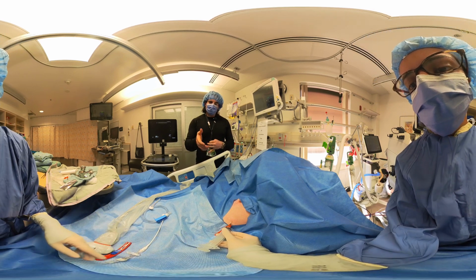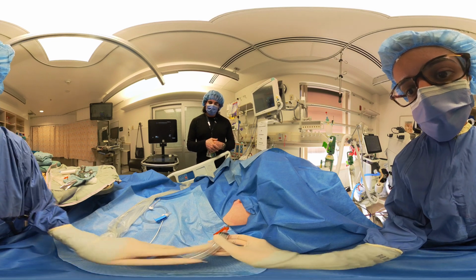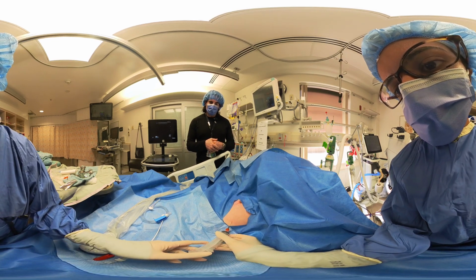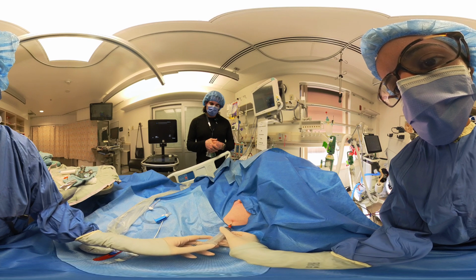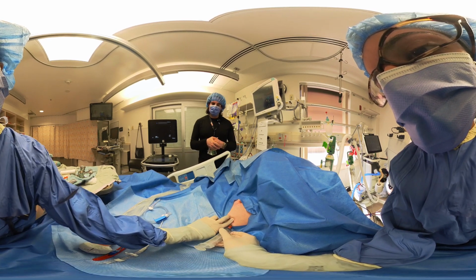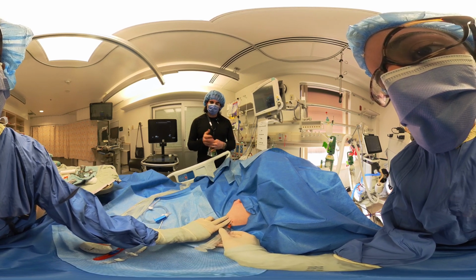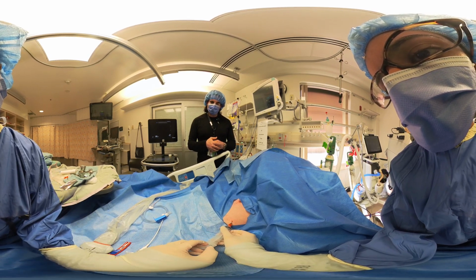Okay, and let's see if we can find a nice trajectory. Can you pass it all the way to the pleural space? Yes, yeah. So if you hit the rib, just go over. Hit the rib, go over, and just keep aspirating with your other hand to make sure you are satisfied with your approach. Because that is the key here. Okay, aspirate continuously as well.